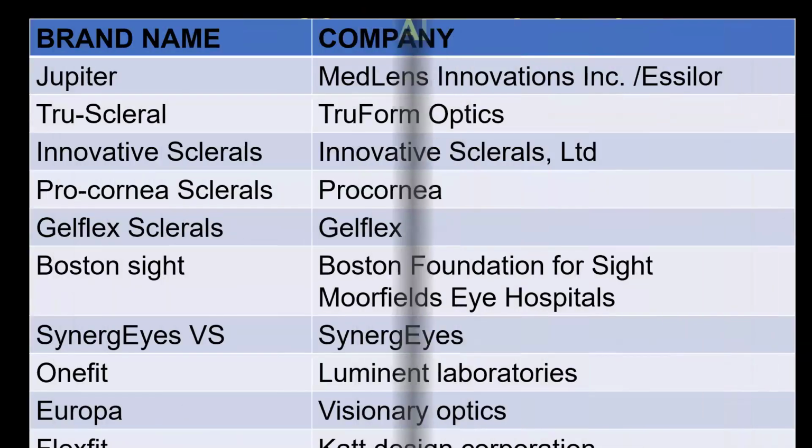Okay, so I'll go straight to, again, I have to disclose that I have no interest in the brands, like Dr. Osazee did. But what is important with the brands of scleral contact lenses is to consistently use the same brand. Although all the brands have the same uniform things they contain. For instance, they have sagittal height, base curve requirements, clearance requirements, and all of that. All of them have that.